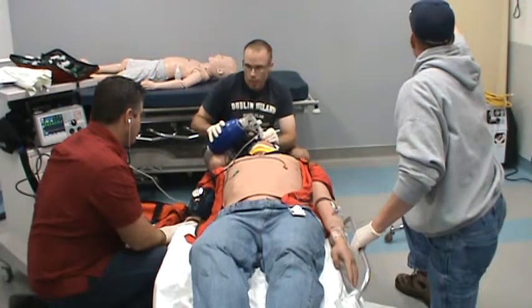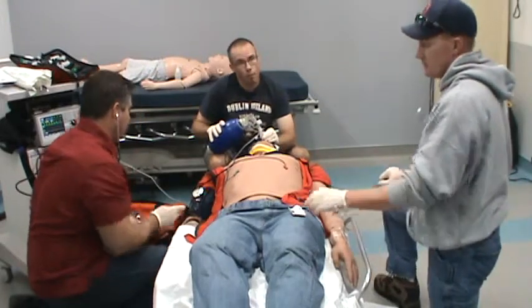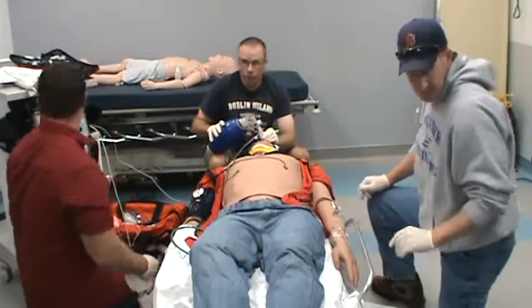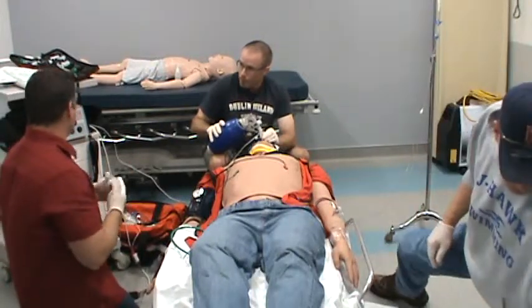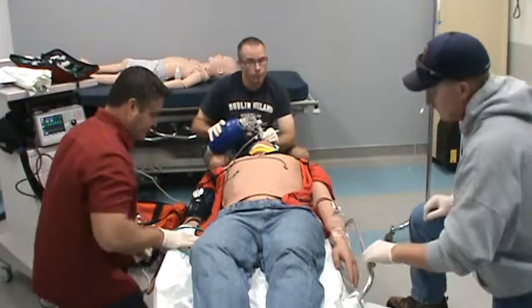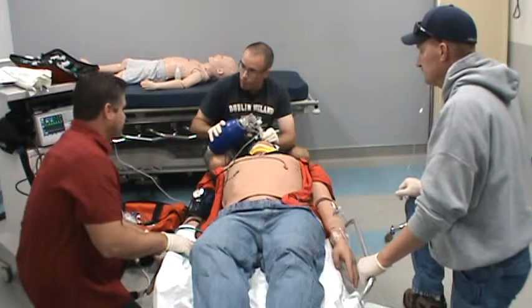I'm going to have you guys help me keep an eye on the patient. If we notice any spiking in the heart rate, we might have to redose the ketamine at a full 200 milligrams. Blood pressure's unchanged, pulse ox is 97. 97, all right, we're getting better. And it seems like our end tidal is getting down close to 40 now.